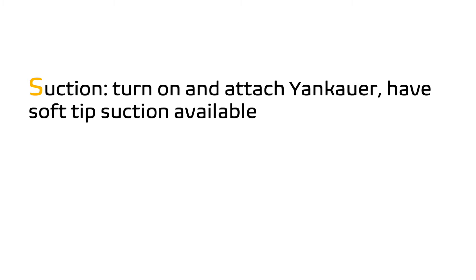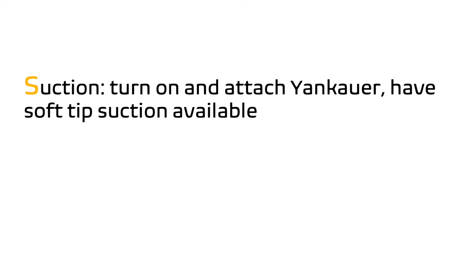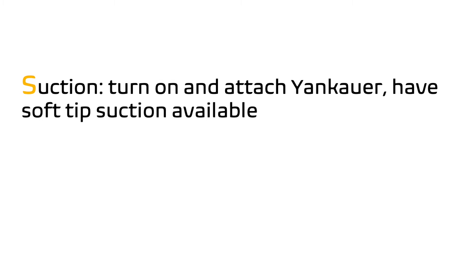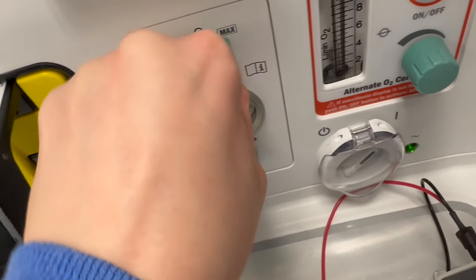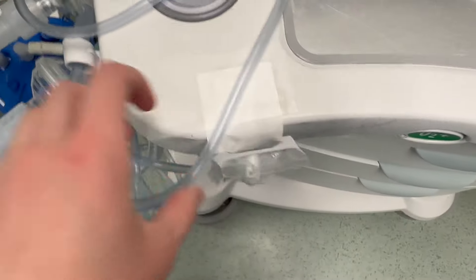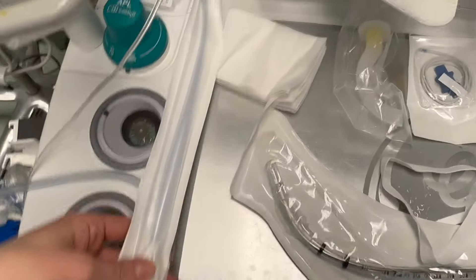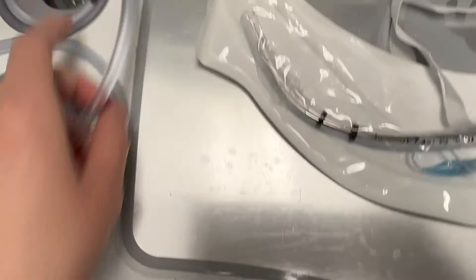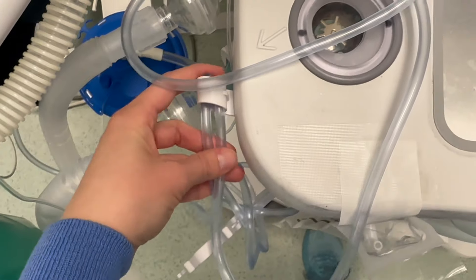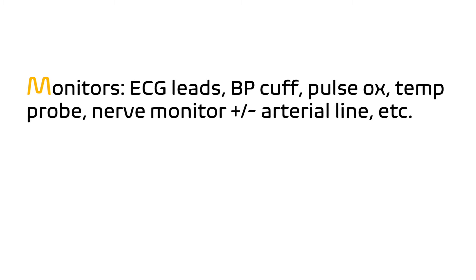The next step in setup is S, which stands for Suction. Turn on the machine and attach the Yankauer tip. Have the soft-tip suction readily available. Here I have my soft-tip suction taped to the machine and the suction line connected to a Yankauer tip. I have the suction line kinked off so we don't have to hear the annoying sound.